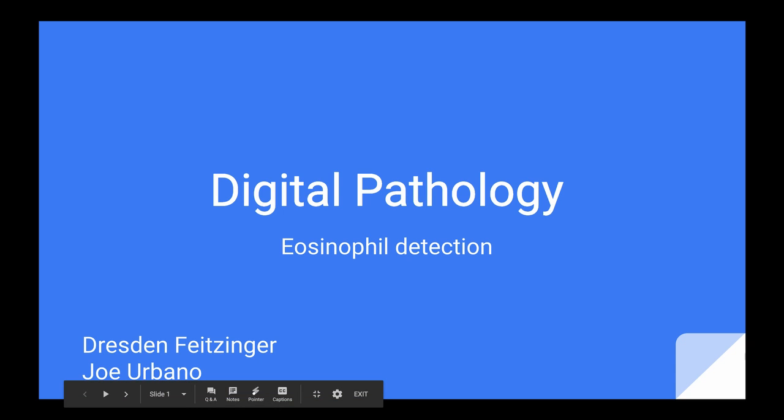Hi, my name is Dresden Feitzinger. I'm Joe Urbano. We are here to talk to you about detecting a certain type of white blood cell in a nasal biopsy sample called an eosinophil.